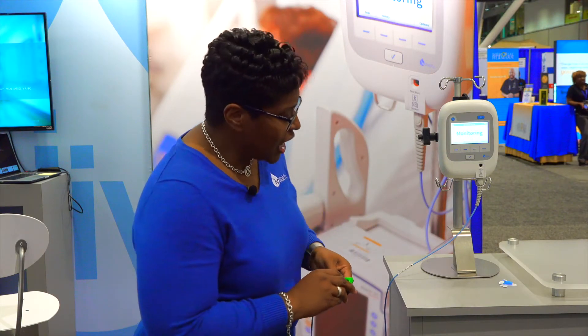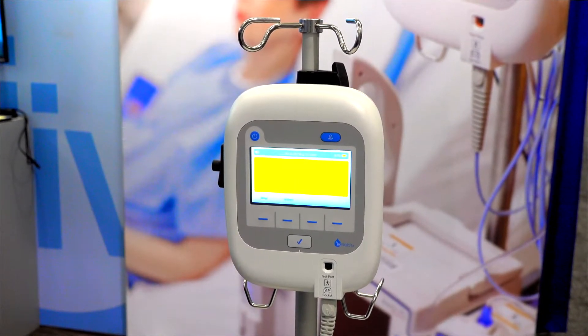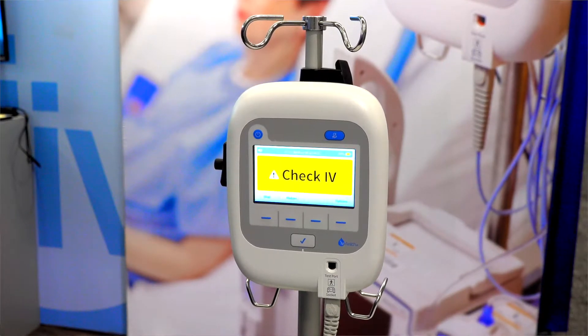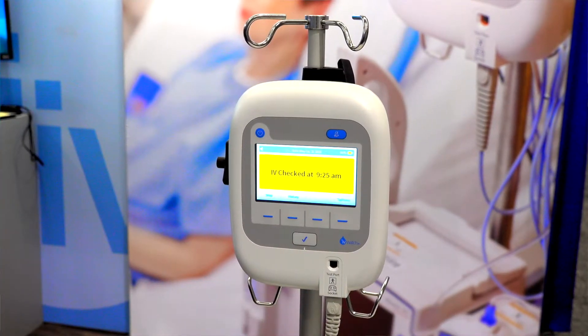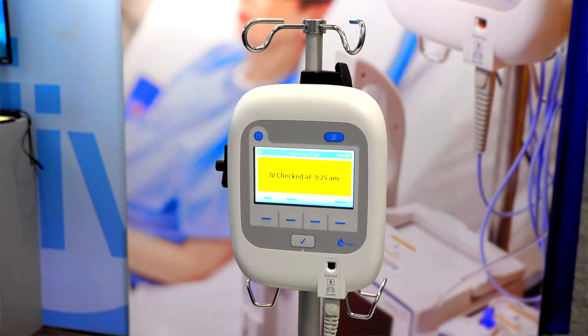Now we're going to simulate an infiltration. You're going to see one and hopefully two alerts. The first alert is a yellow 'Check IV' alert — you'll see it on the screen and get an audible alert as well. That signifies that something has changed from the baseline assessment, signaling you as a clinician to come over and check the IV site. You might think everything looks fine; come over and hit the 'Check IV' button. You'll get a time and date stamp of when you checked the IV, and then the system will continue monitoring.